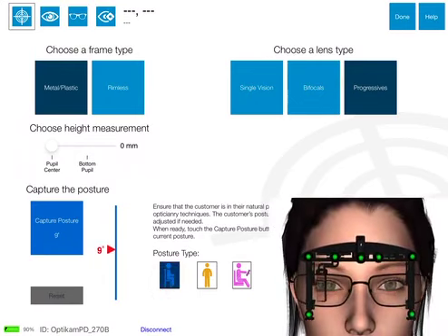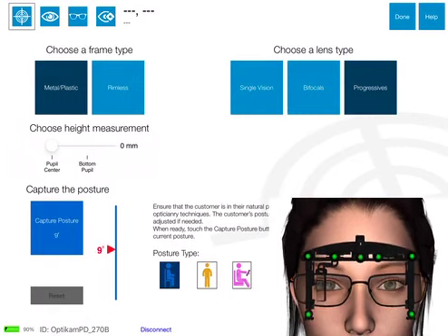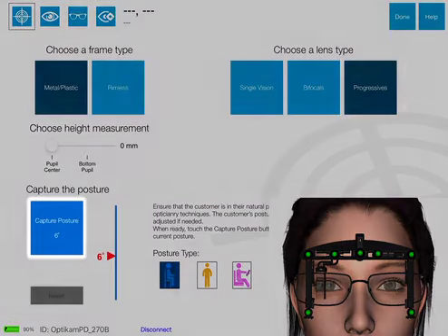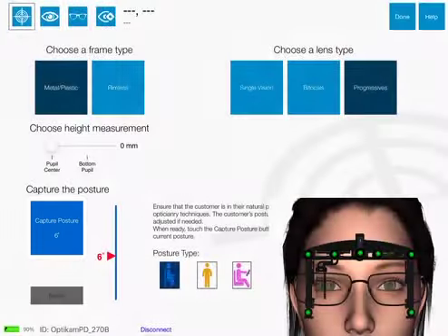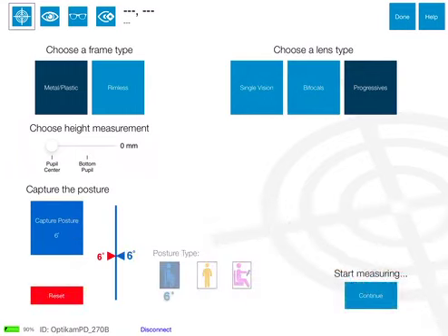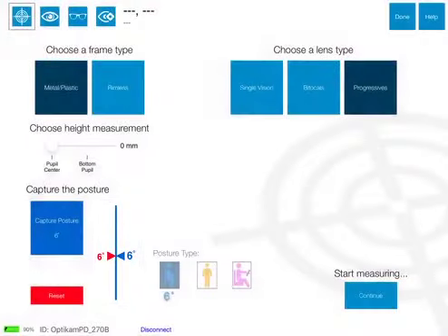Using your experience, observe the customer and, if necessary, guide them until you best judge them to be in their natural posture. When ready, touch the Capture Posture button. The captured posture, represented as a pantoscopic tilt angle, will be marked on the posture indicator bar next to a live pantoscopic tilt reading.